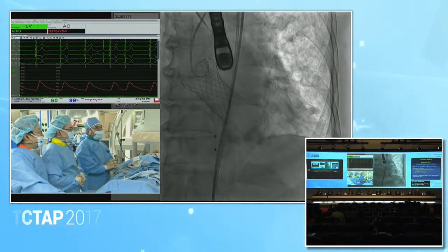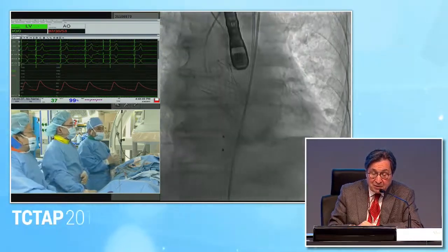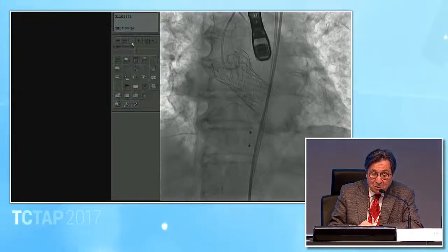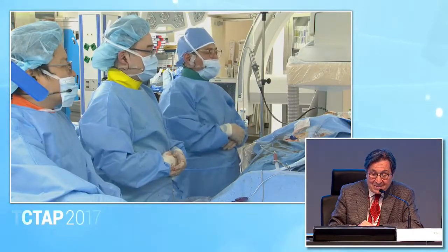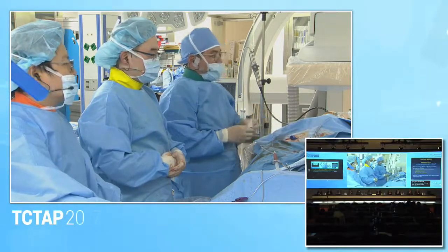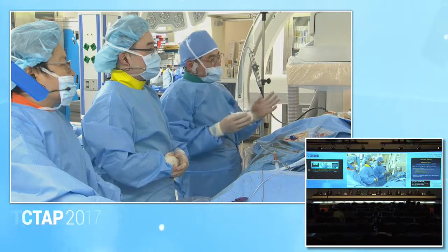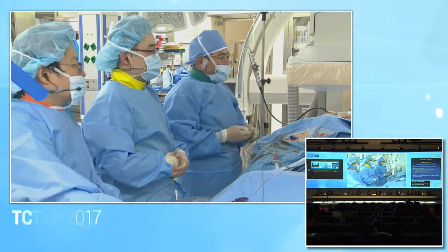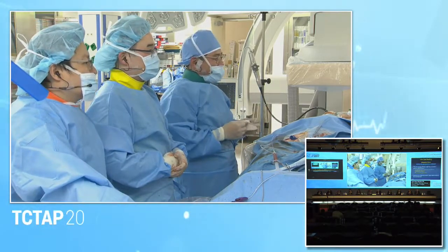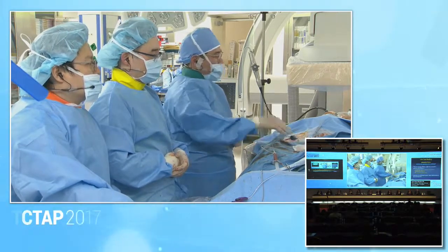Well, thank you very much for a wonderful case, very educational for all of us. Thank you indeed for your expertise. Okay, thank you for sharing the case with me. It's the first time I did three recaptures and repositioning, but very interesting case. It's very useful to me and our team. Thank you very much.